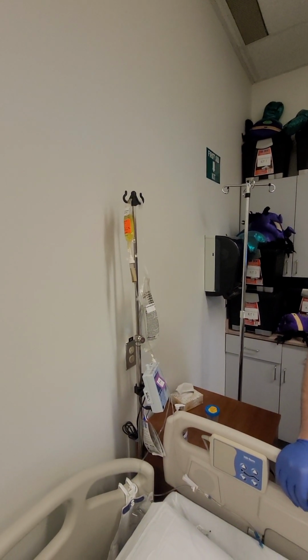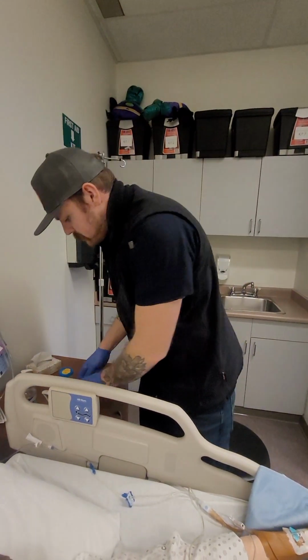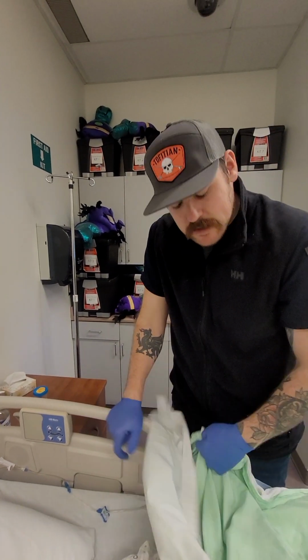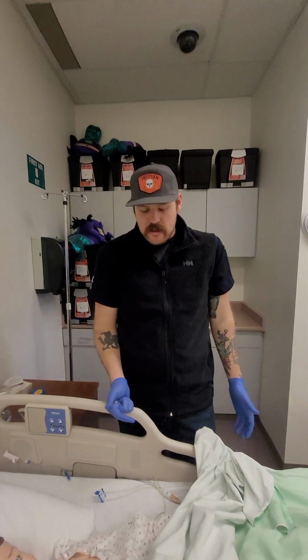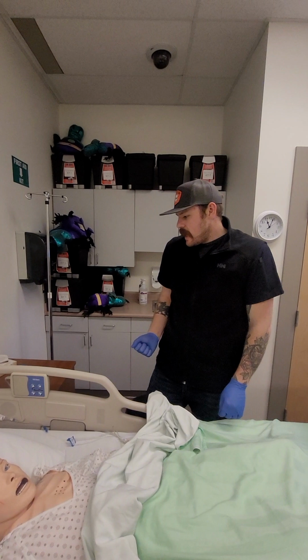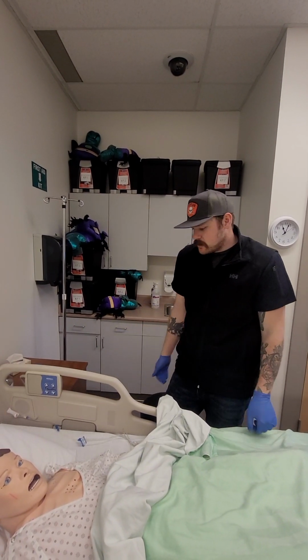our line. We're not hearing any alarms. Make sure the pump's all set up properly, the pump's plugged in. We're going to ask the patient if they've got any questions, if we can provide any teaching around some of the adverse effects that the medication could have, if it was their first time, and make sure the patient's call bell is in reach. In case they do have one of those adverse reactions, they can give us a call.